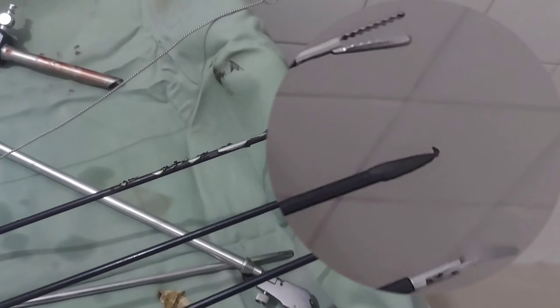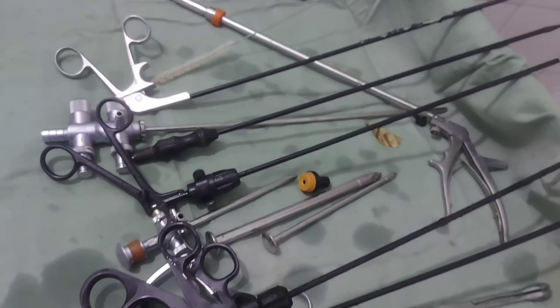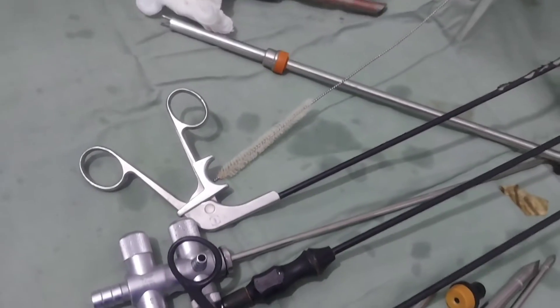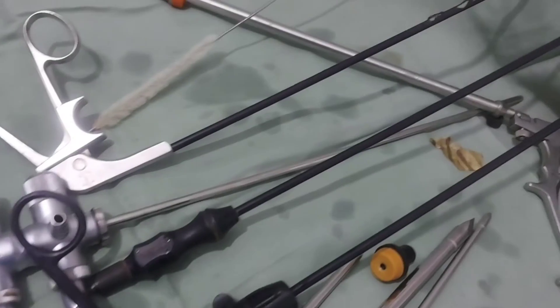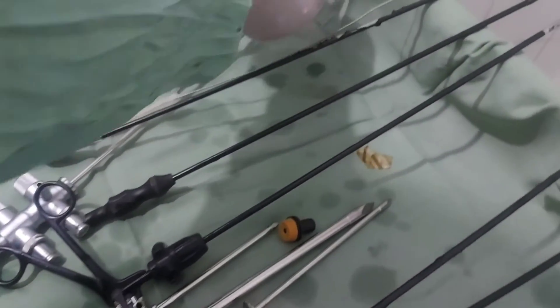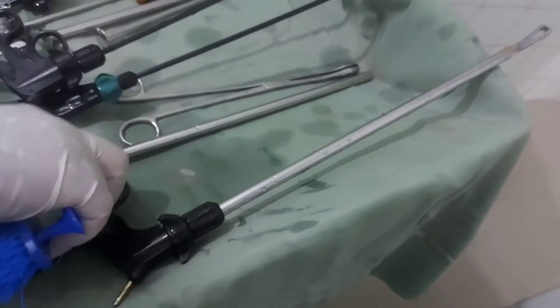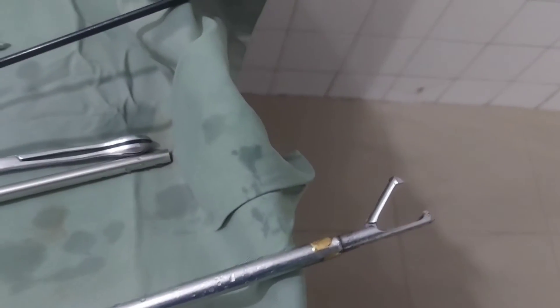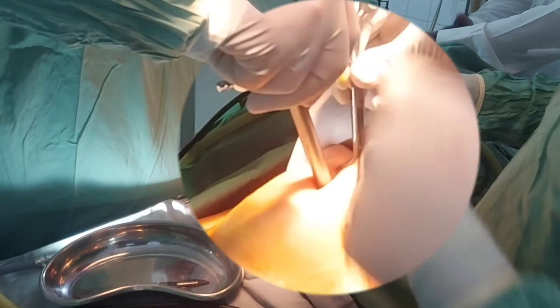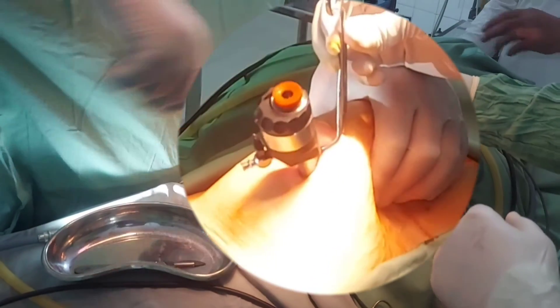First instrument is scissors, next is the L hook, and this is the gallbladder grasper. These instruments also have different lengths; longer instruments are used in obese patients. This one is the clip applicator, used to apply metal clips, and this is the crocodile, used to extract the gallbladder.